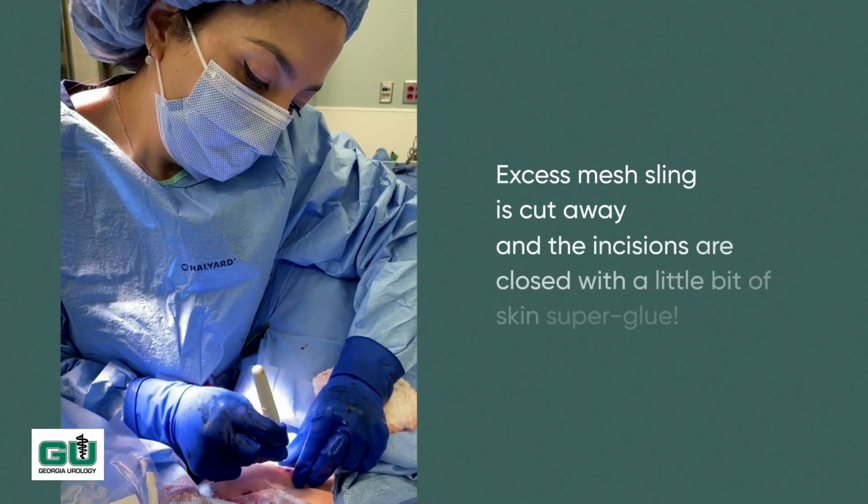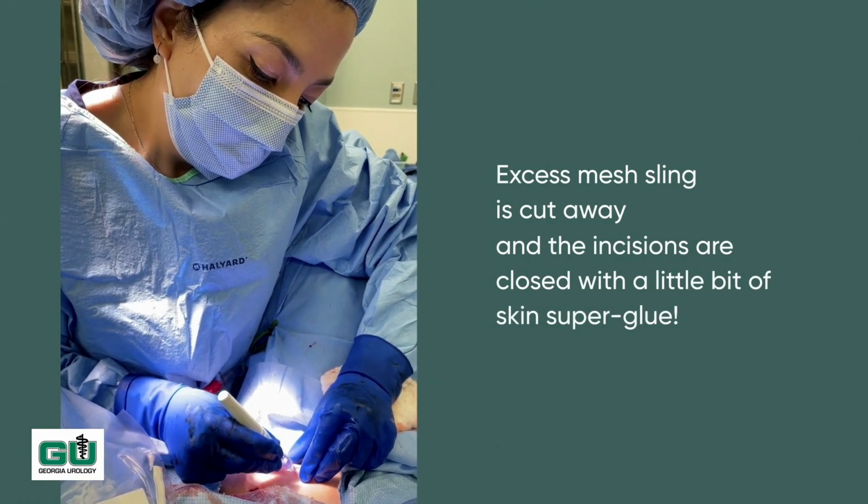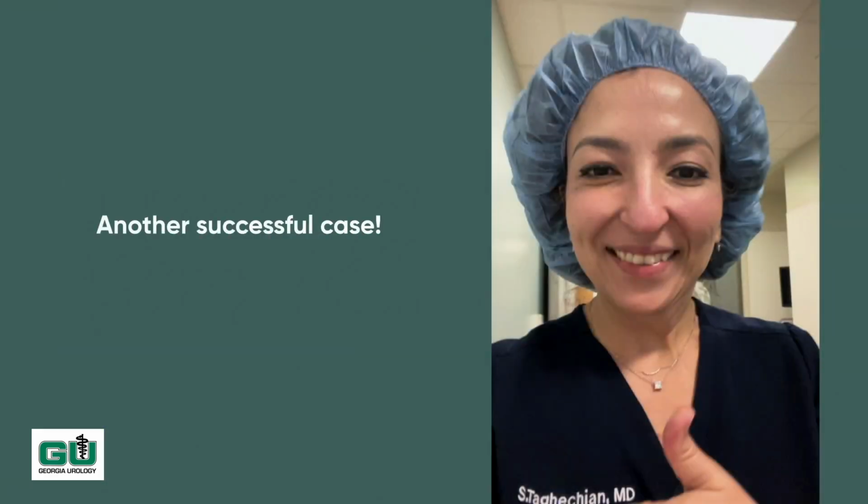The excess mesh is cut away, and I close the incisions with super glue and dissolvable sutures. Another successful case.